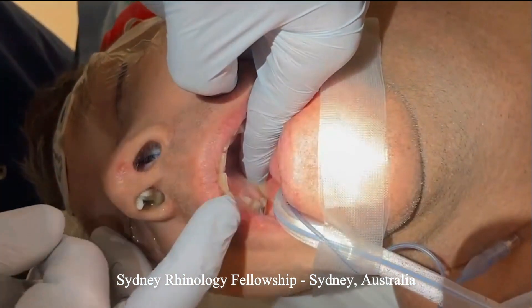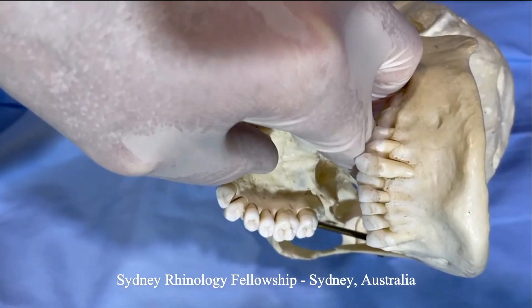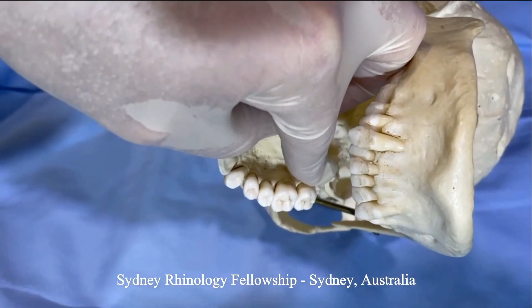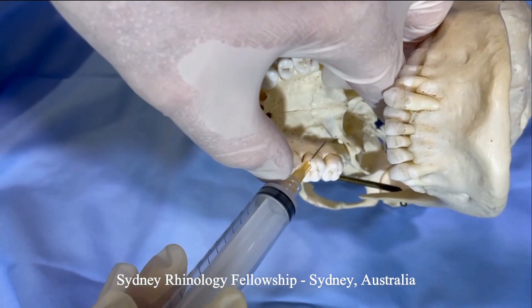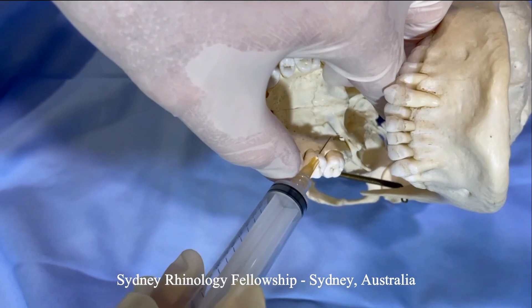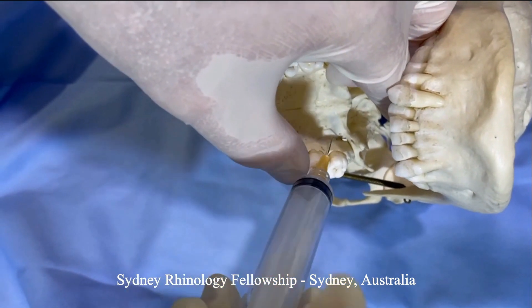The first location to find is the foramen. One feels and palpates for the maxillary tuberosity — you can see on a dry skull here where to find that. The foramen lies opposite the second molar, and one can then place the needle directly down the hole.